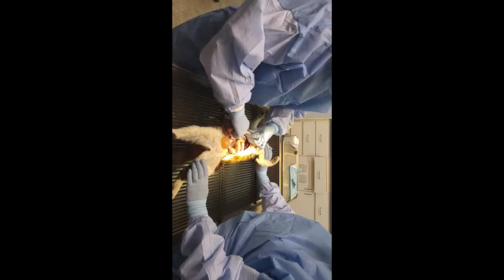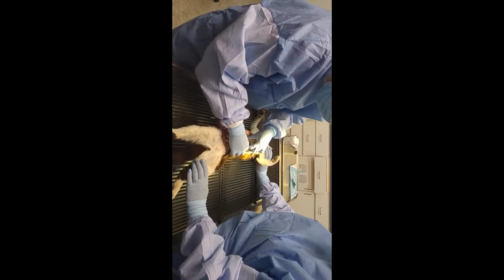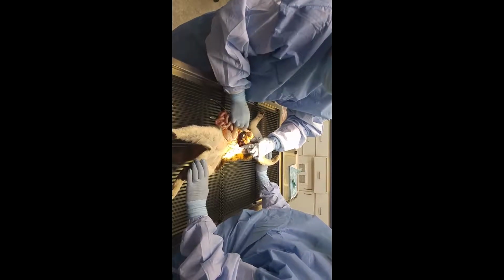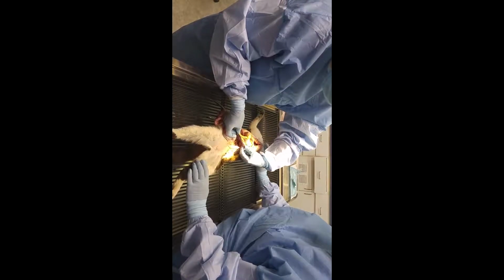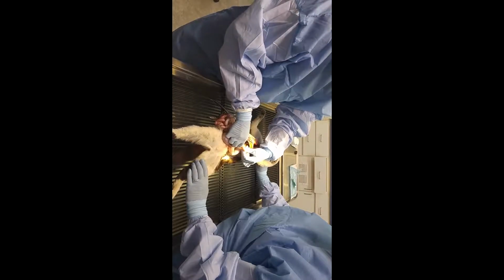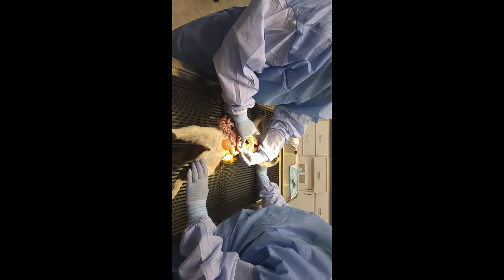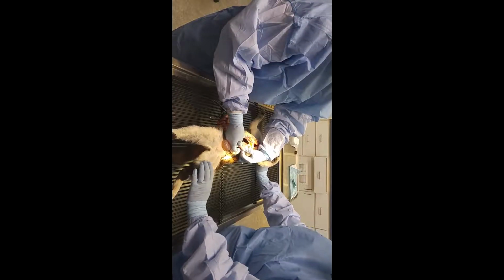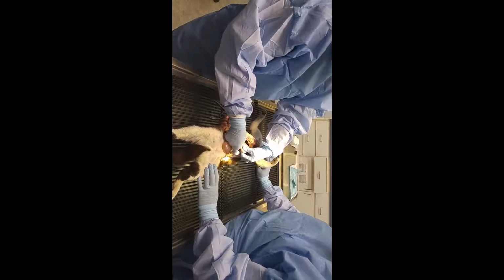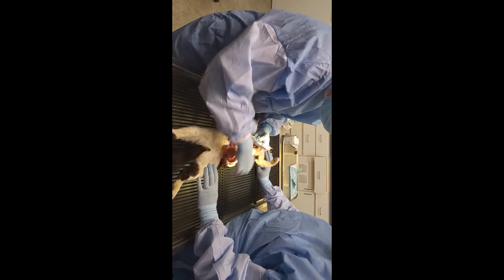One thing we'll say is, and here's her spleen. I was like, where is the spleen? It was tucked under the stomach there. Very small, which is normal for a cat, and smooth, no lumps or bumps. The pancreas, which is running along the intestinal tract here, there are some little mottled areas inside of the pancreas, so that may be a good place for us to take a sample. That could be a normal finding, but we'll submit that for histopathology in order to be able to tell.